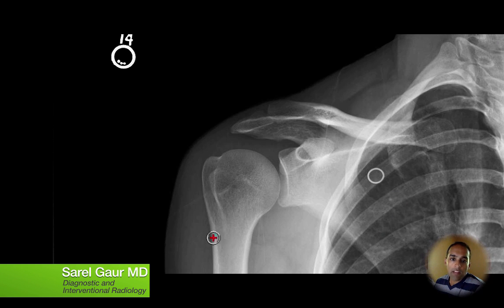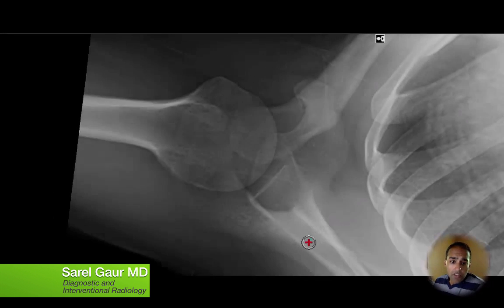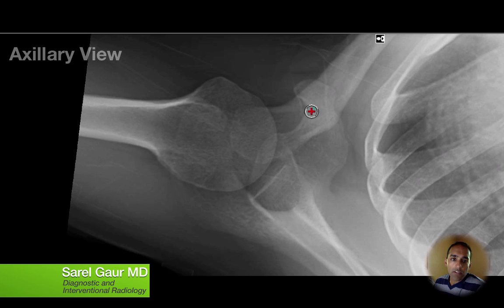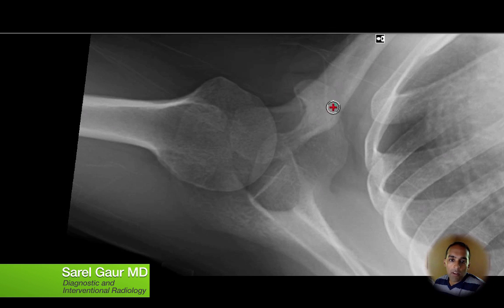Most people start out looking at a shoulder x-ray by looking at the frontal film, but let me show you how I start. I like to go straight to this view right here — this is called the axillary view of the shoulder. You can see there's a lot of bony overlap here, so it's a little confusing, but you can find this bony projection right here and that's the coracoid process. So now I know that this is anterior and this is posterior.